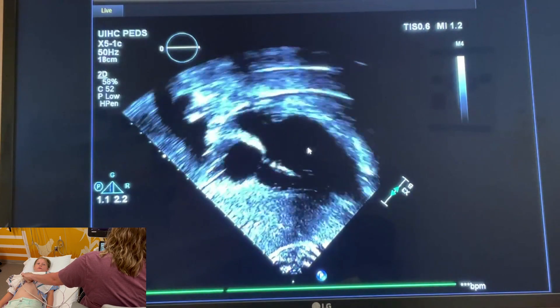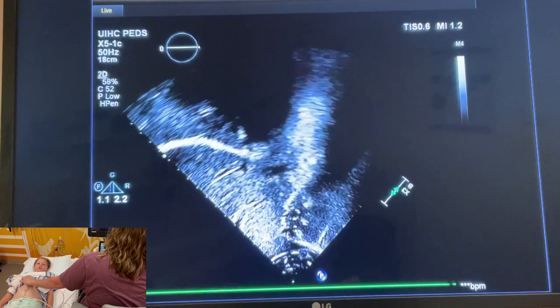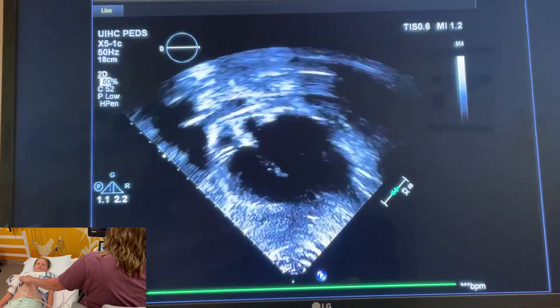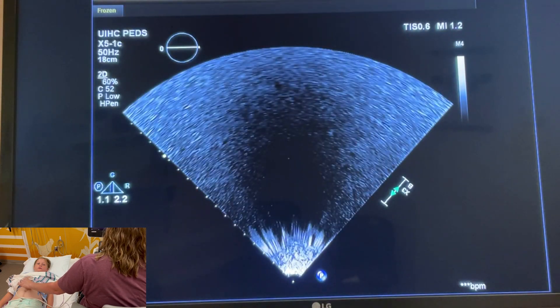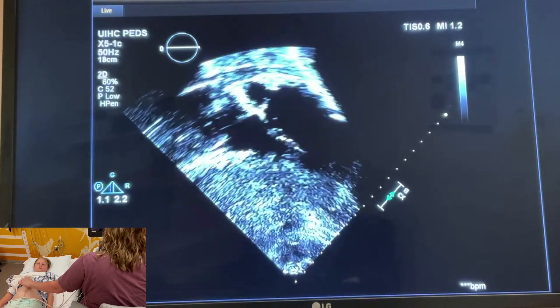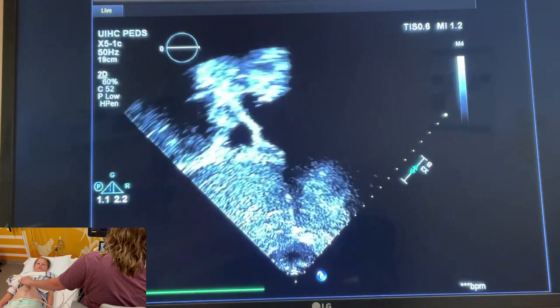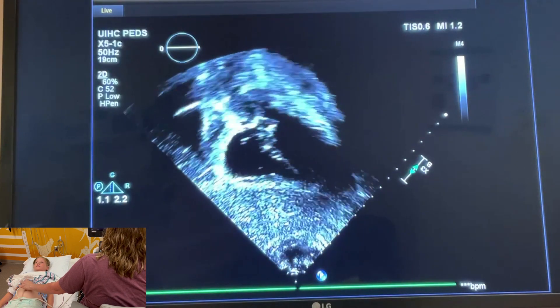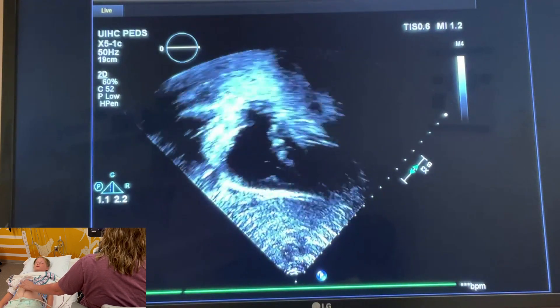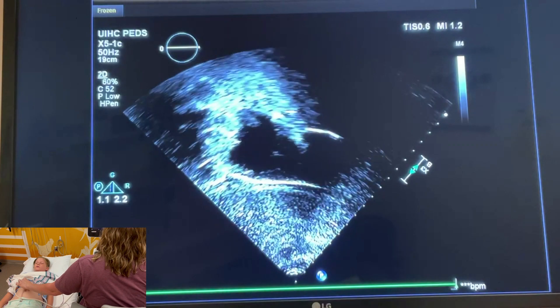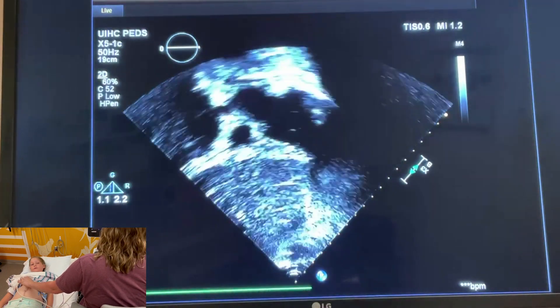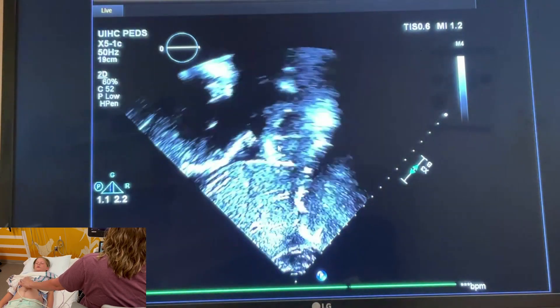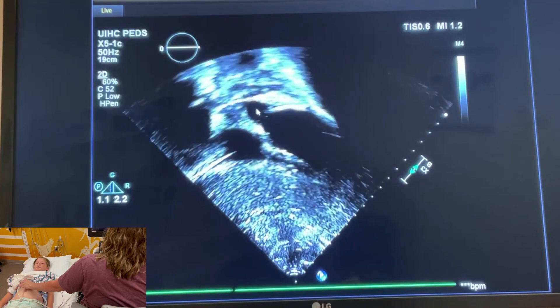We'll do a sweep up to show that, and then if you keep tipping anterior we're going to see the great arteries arise. I'm going to tip up — the first branch is the aorta typically, and then the pulmonary artery. Here coming up: this is aorta, pulmonary artery.